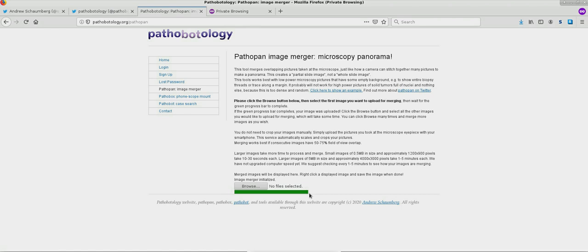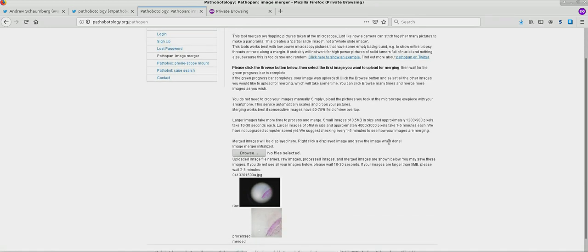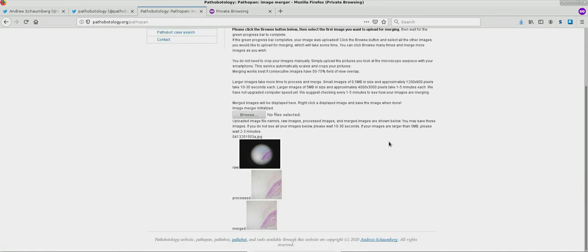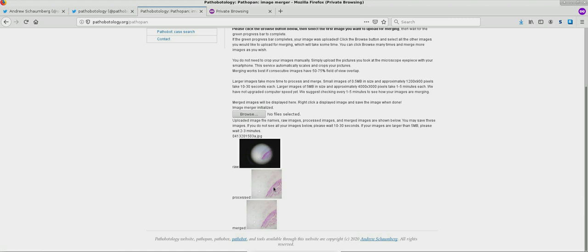It will take between one and three minutes to process. Larger images take more time, but this will take some time in order to process. The instructions above outline some more details about that. And we see now the first image has been taken. It's taken by a smartphone at the microscope eyepiece and the processed images, which are approximately squares, are visible beneath that.